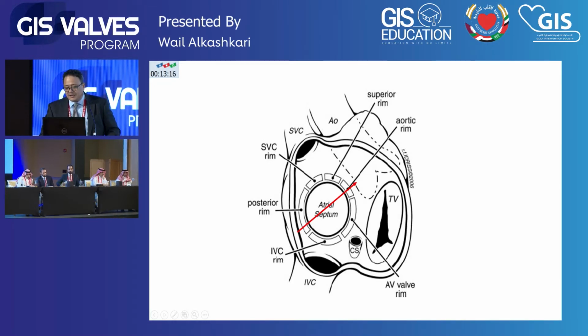So this is the AV rim, that's the one you see in apical four chamber. This is the aortic rim. I will skip this. This is the SVC rim, and this is the posterior rim, and this is the IVC rim.